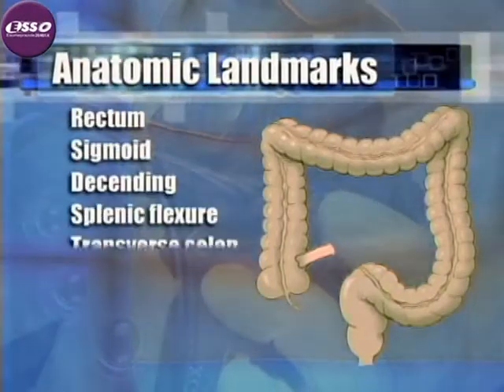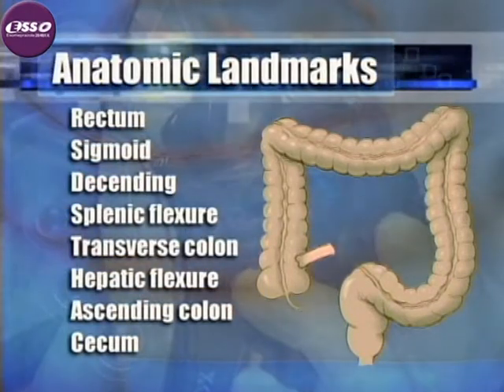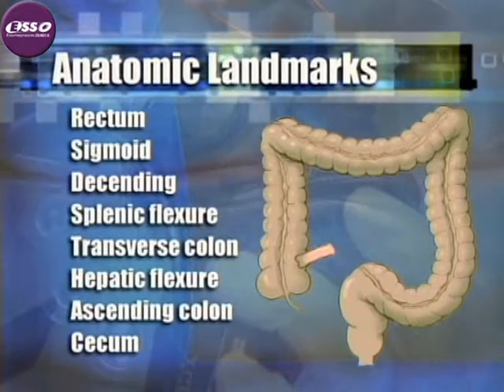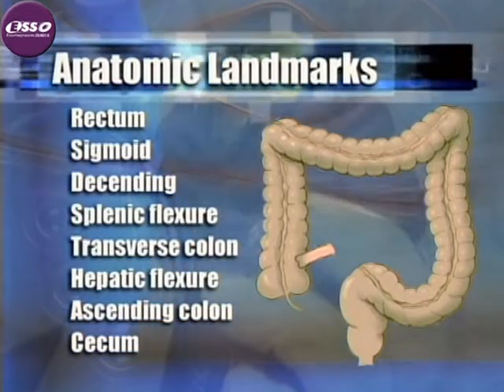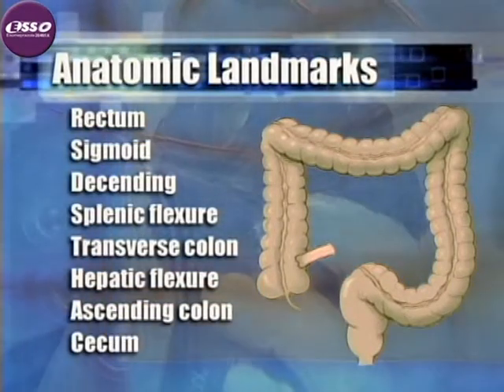It's useful for a colonoscopist to know the standard information about landmarks, but I want to say at the outset that there are only two areas of the colon where you can reliably say that you know for sure where you are, i.e. what section of the large bowel you are in. One of these areas is the rectum and the distal sigmoid.